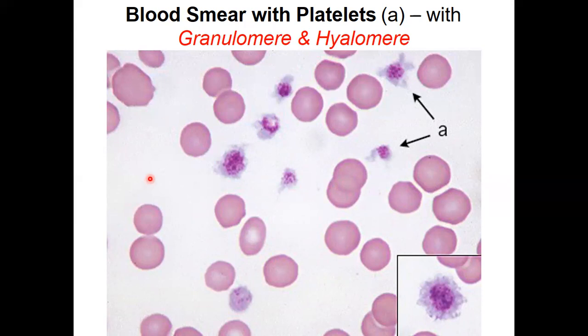So we have finished the part of blood smear. Now let's look at a bone marrow smear. So we are now taking a sample of blood from the bone marrow, where we have a chance of seeing cells that are not yet mature, because the cells found in the peripheral blood vessels are mature cells. Okay, so we call it a peripheral blood smear. Most of the cells you find there are mature, but in the bone marrow smear, you're going to find also immature cells.